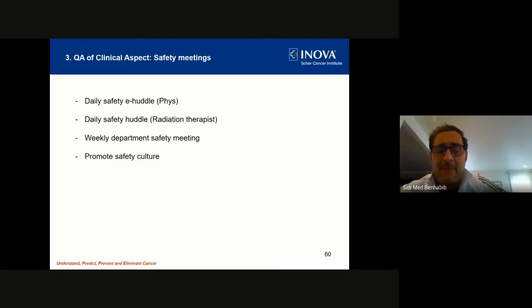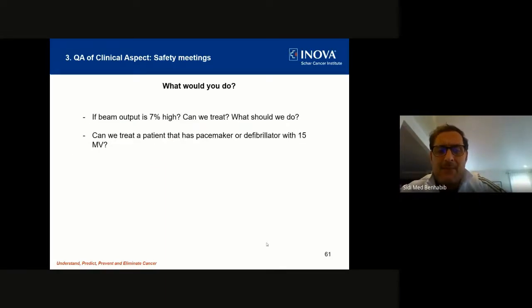Next slide. So these are just two quick questions that I wanted to ask the audience. If you are called to the machine as a medical physicist and your output is 7% high, what would you do? Would you treat, or would you not treat? As we saw from the recommendations of TG-142, above 5% we cannot treat. We have to check the output.